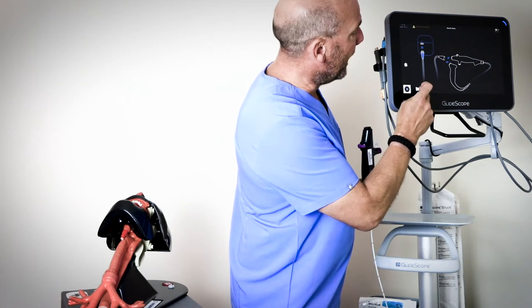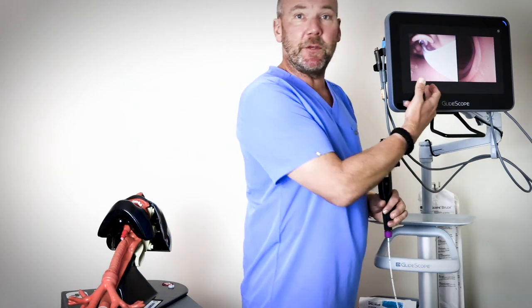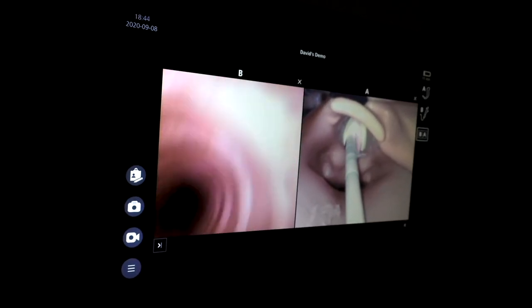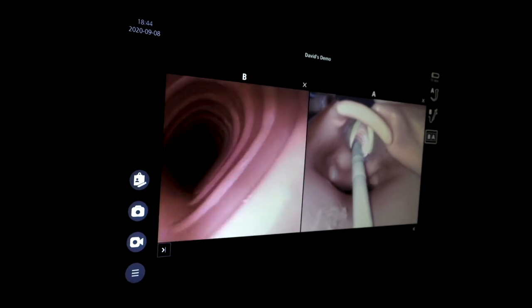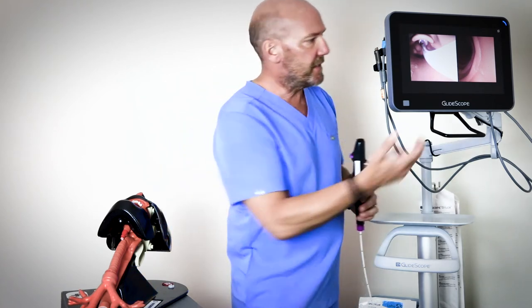It's the only system today that allows two simultaneous views of the airway, which is really important if you're managing a particularly difficult airway and you want to buddy up with another clinician who can provide a secondary view from a video laryngoscope blade while you drive and deliver the scope itself. We know it can be frustrating when you're running up against anatomy but not quite sure what that anatomy is and what might be prohibiting your ability to advance the scope. The secondary view gives you that information and allows you to make the necessary subtle changes to drive and deliver the airway safely.